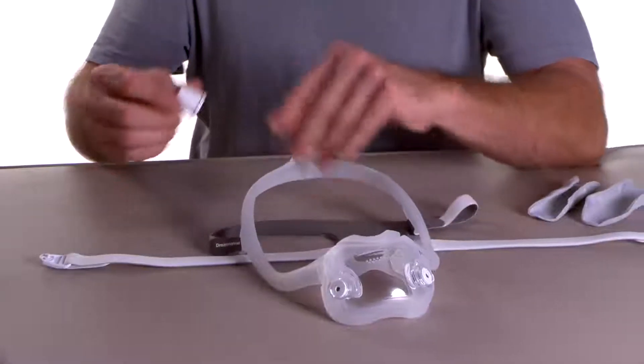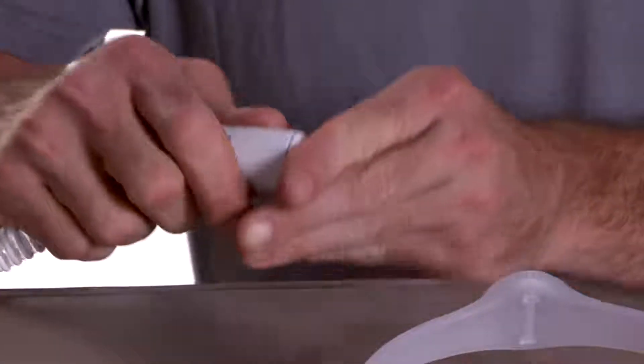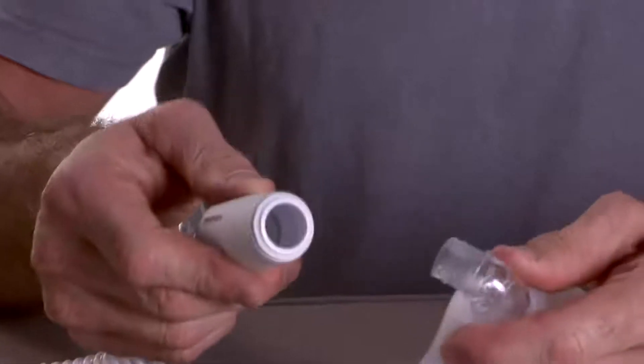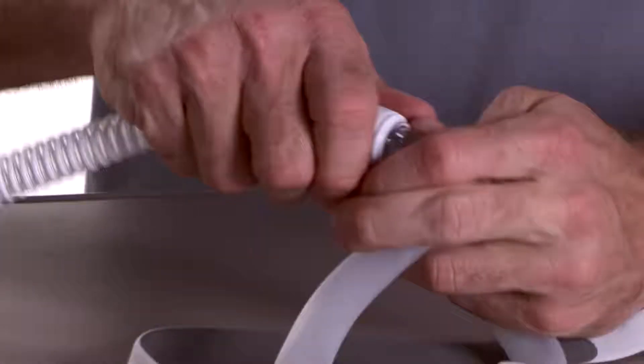Push the tubing quick release into the tubing that came with the CPAP device. Notice that the tubing quick release lets you easily disengage from the device, which is convenient when you get up to use the bathroom at night.